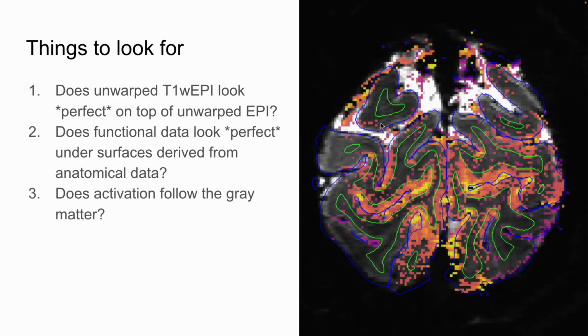And then if I overlay some activation map on it, is that activation in the gray matter? If you have something go wrong in your path that introduces wicked spatial correlations, a quirk of the data set that I'm sharing is that it was acquired on the parallel transmit system on our 7T-AS. When y'all acquire data this afternoon, you're doing it on this single channel system, right, with a NOVA?